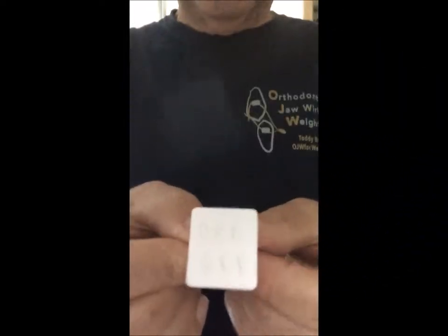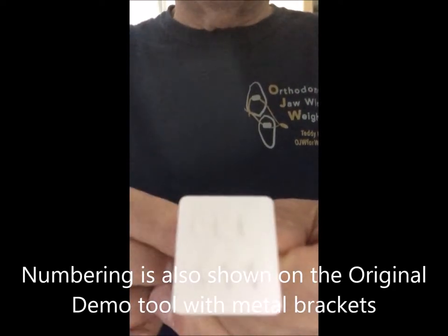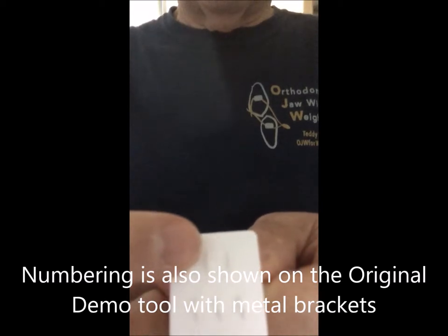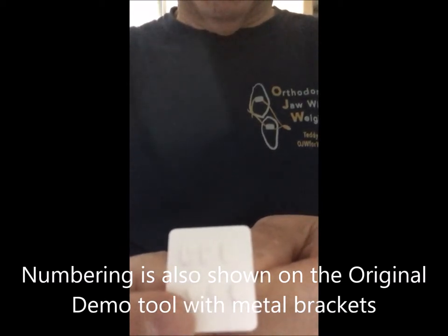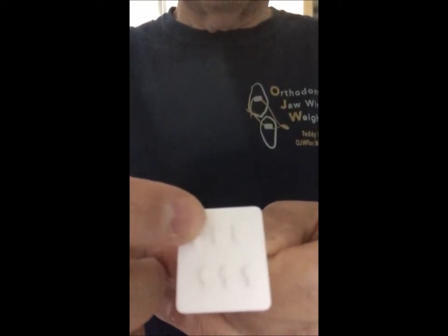I'm now going to show you how the patient would use the OJW demo tool to practice wiring and rewiring. First, you must understand the order of the brackets. That would be 1 and 2, 3 and 4, and 5 and 6. Again: 1 and 2, 3 and 4, and 5 and 6.